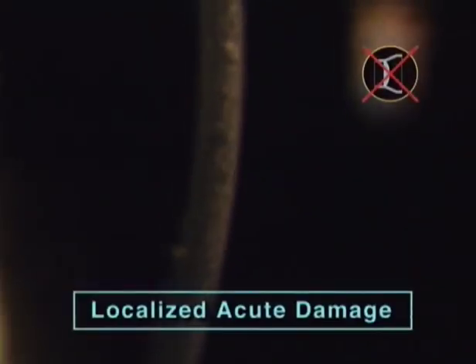Another type of damage is shown in this cornea, which has been hit by particles from an explosion. These particles have caused a strictly localized circular endothelial disruption. With the corneal contact glass, we recognize the circular impacts on the endothelium. One day after the event, we still see the lesions here and here. We already observe an attempt at endothelial repair with an elongation of cells and the start of radial alignment here.